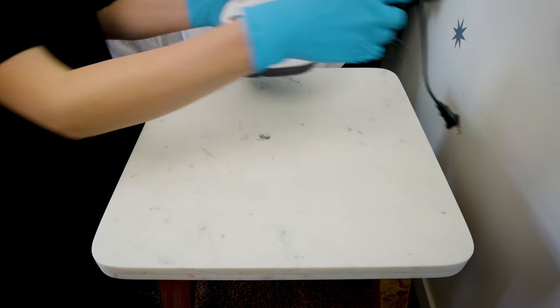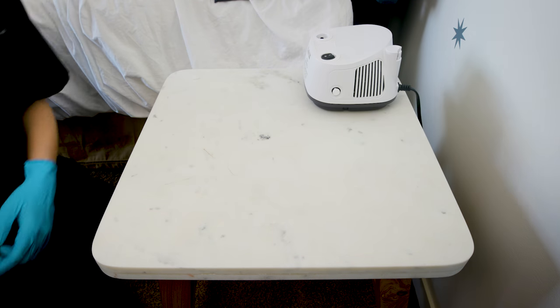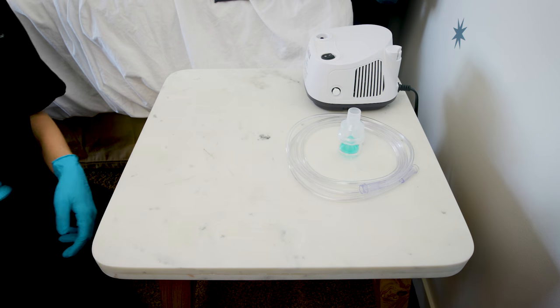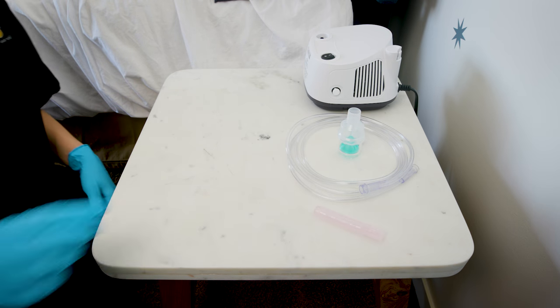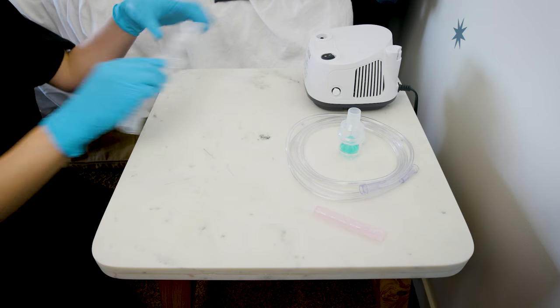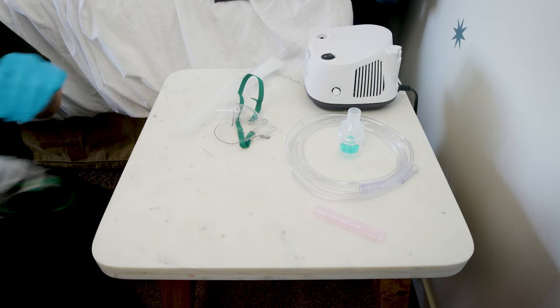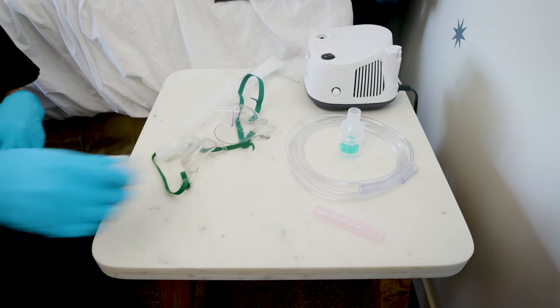Gather the supplies you need: a nebulizer machine, also called a neb machine, neb tubing, a neb cup, the nebulized medicine ordered by the doctor, and a delivery device, such as a mouthpiece, face mask, trach mask, or T adapter.